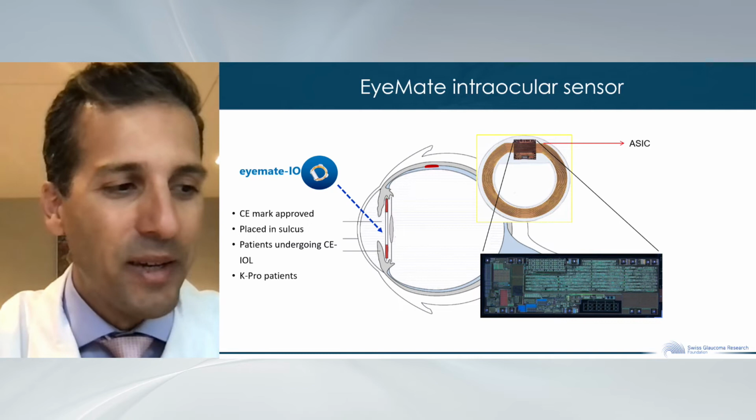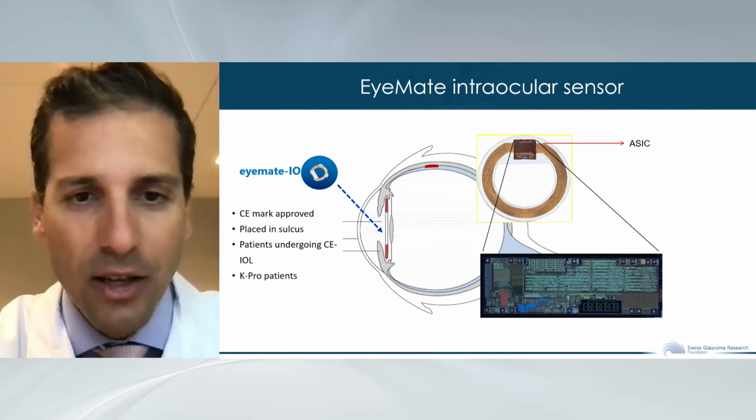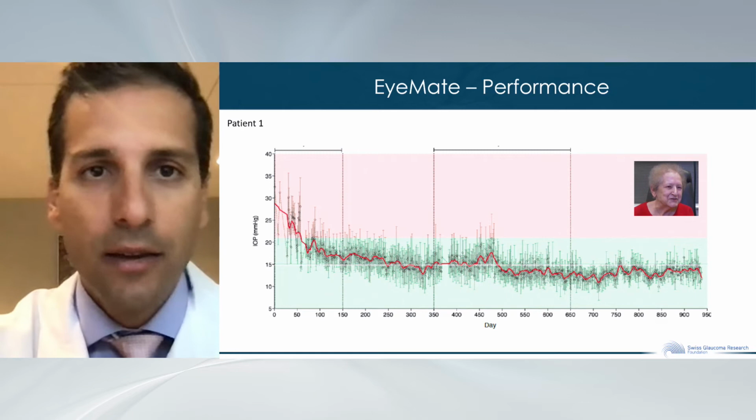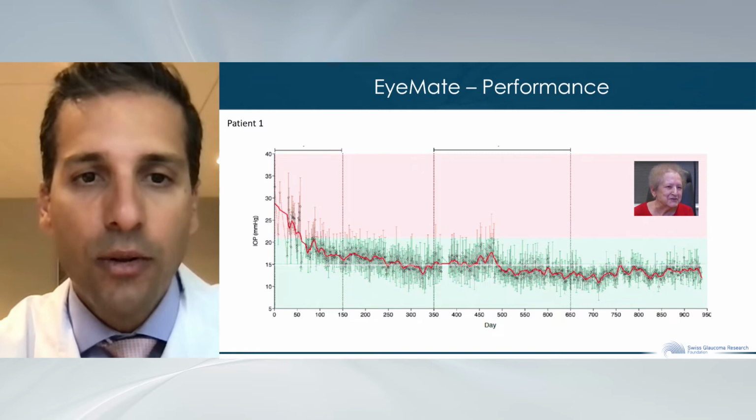This slide essentially answers the topic that was given to me. Why is continuous IOP measurement more important than single tonometry? Look here at this slide. Look at any given day from this slide, and you will see that IOP varies from anywhere between 5 to 25 on any given day. And you see how in a supposedly well-controlled glaucoma patient, how unstable IOP is on every day.